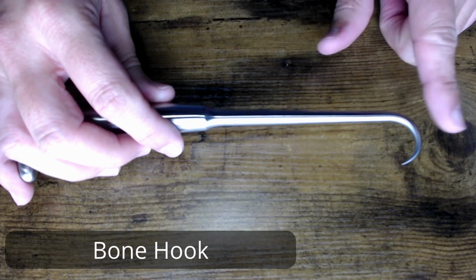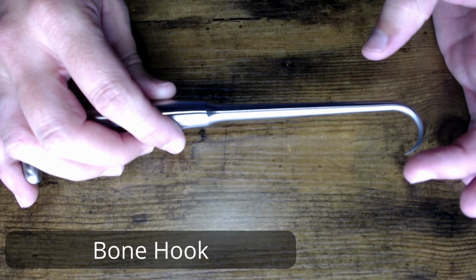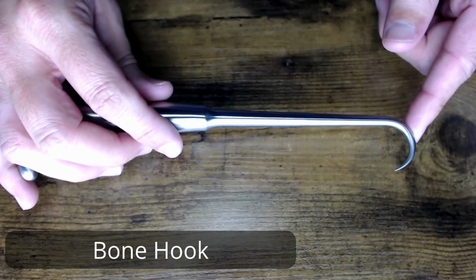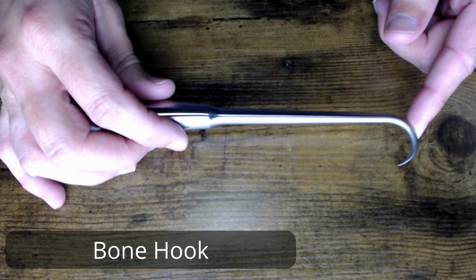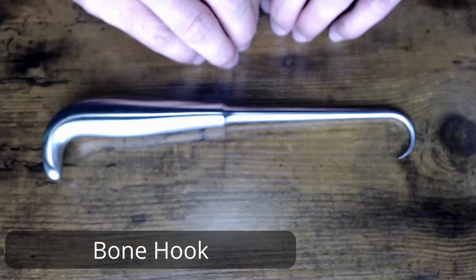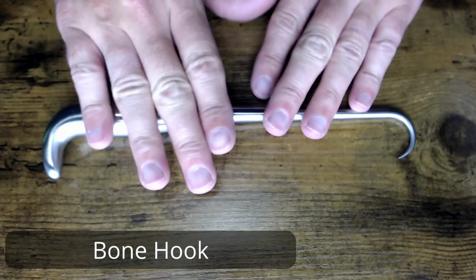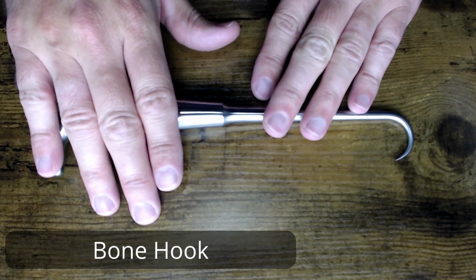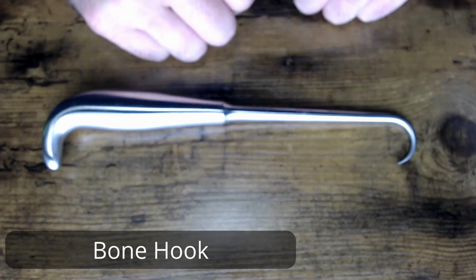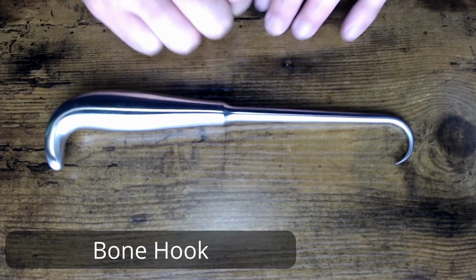Because it is a sharp, sometimes you want to put that little tip protector on. You got some square protectors. Sometimes you can put a little smaller protector there on the end to protect your teammates in the operating room as they're opening up and setting up for these trays. It is kind of a heavier device, so this one's okay to go toward the bottom of your tray if you have some other instruments there that you're reprocessing.